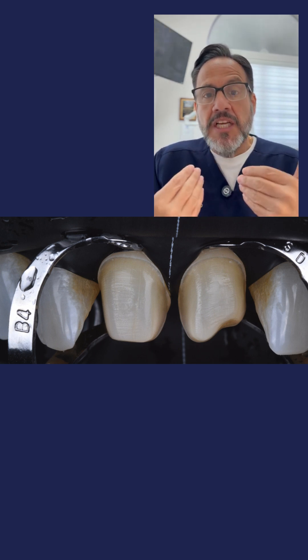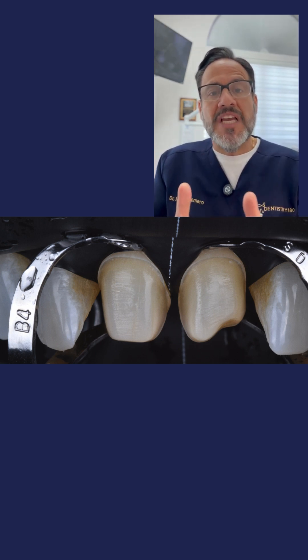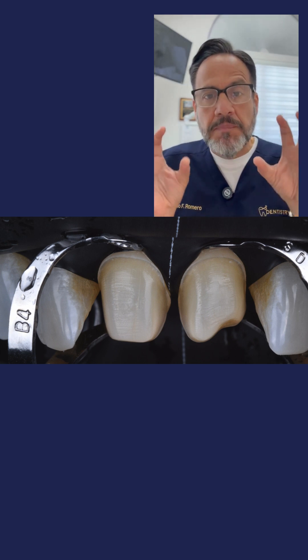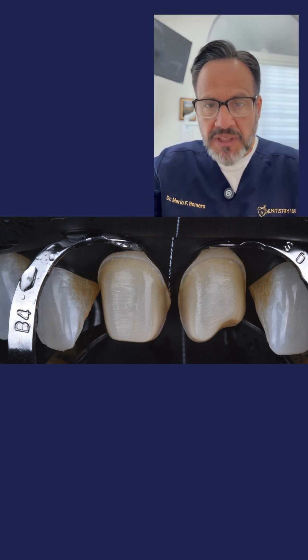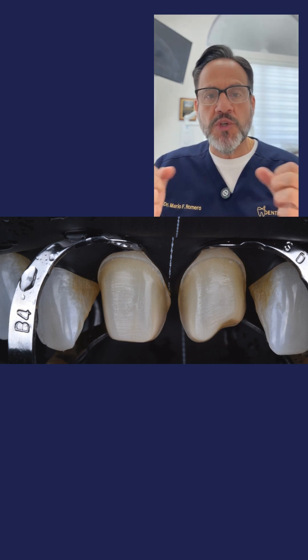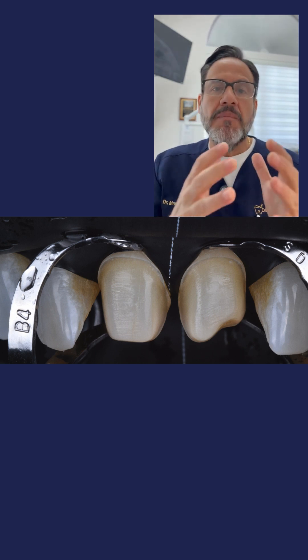You also need that spacing because you're going to use a retraction clamp. As you're seeing in photo number one, there are two B4 clamps, and those clamps are pushing that rubber dam subgingivally, pushing the tissue apically as well, so that you can have full exposure of a very nice and clean margin.